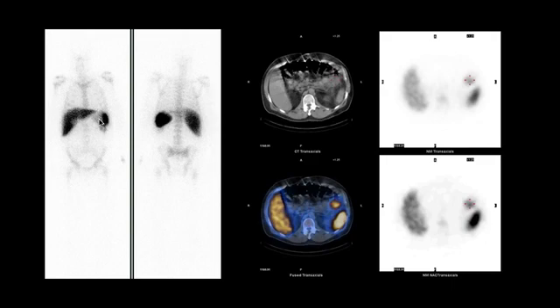On these images, there is a focus of abnormal uptake abutting the uptake in the spleen, which is seen here in the left upper quadrant. This whole body image by itself does not provide much information as to where it is and what is the significance of this focus.